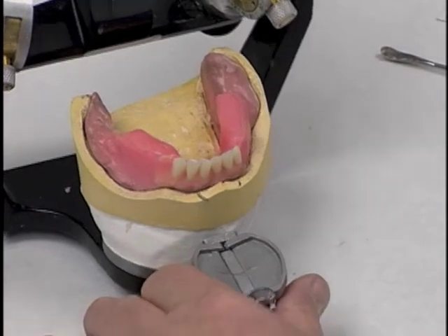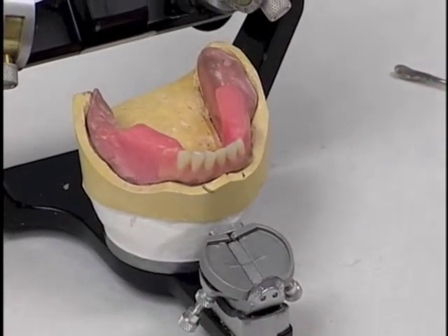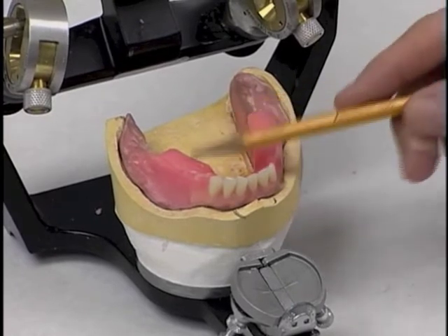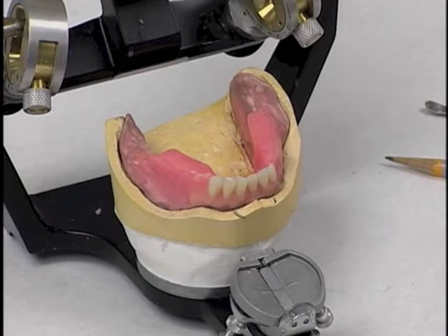In the arrangement of posterior teeth for non-anatomical occlusion, it is important that we not only control the vertical plane, the plane of the occlusion, but we also need to control the occlusal surfaces and keep them on a very flat plane so that we do not have curvatures in them, either in an anterior, posterior, or a lateral direction. The occlusal surfaces of all of those posterior teeth should be perfectly flat.